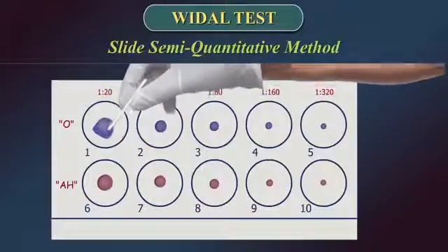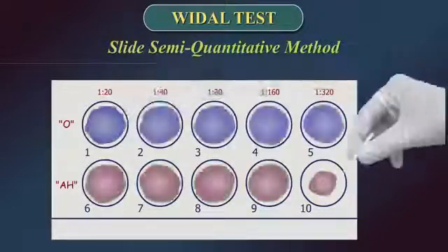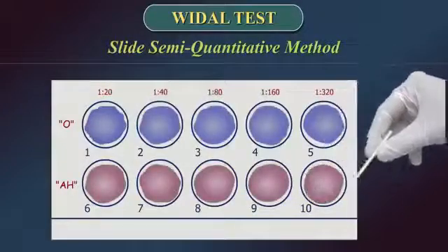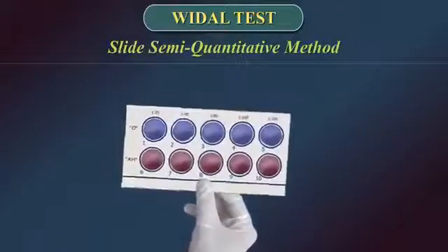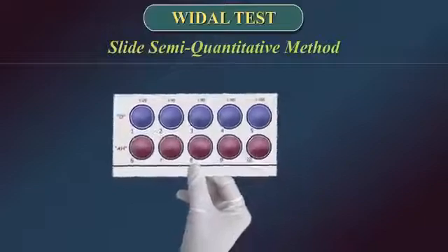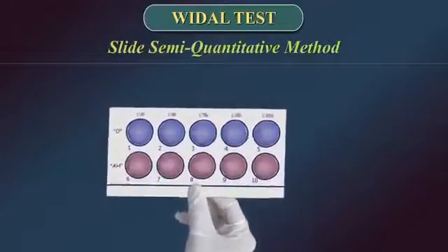Using separate mixing sticks, mix the contents of each circle uniformly over the reaction circles. Rock the slide gently back and forth. Observe for agglutination macroscopically within one minute.